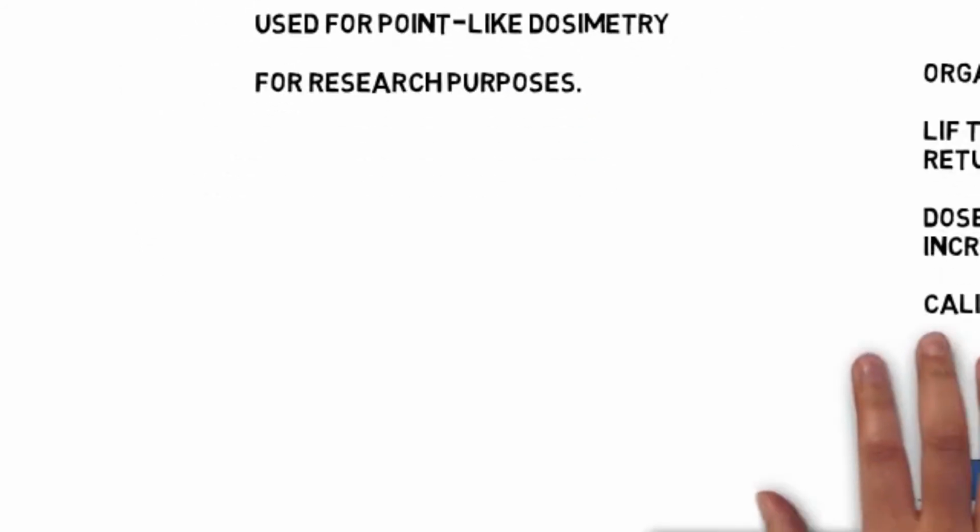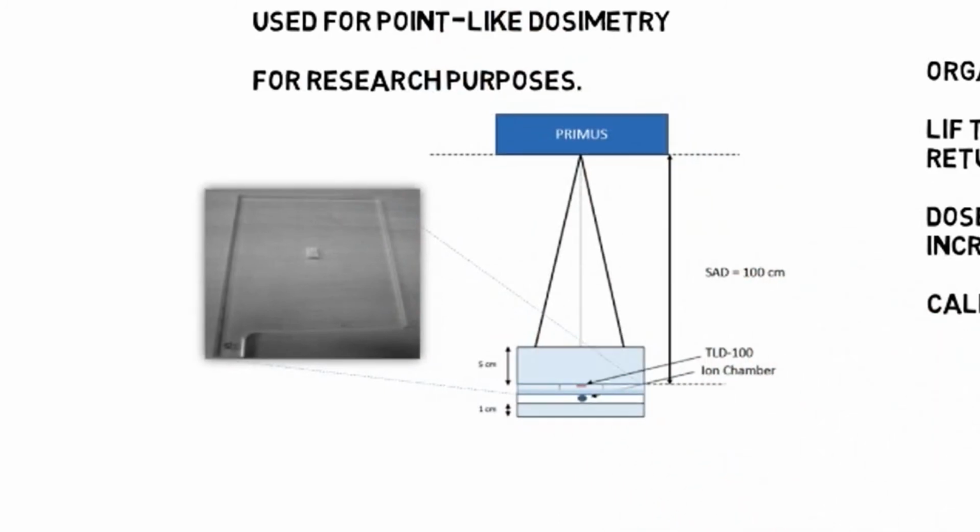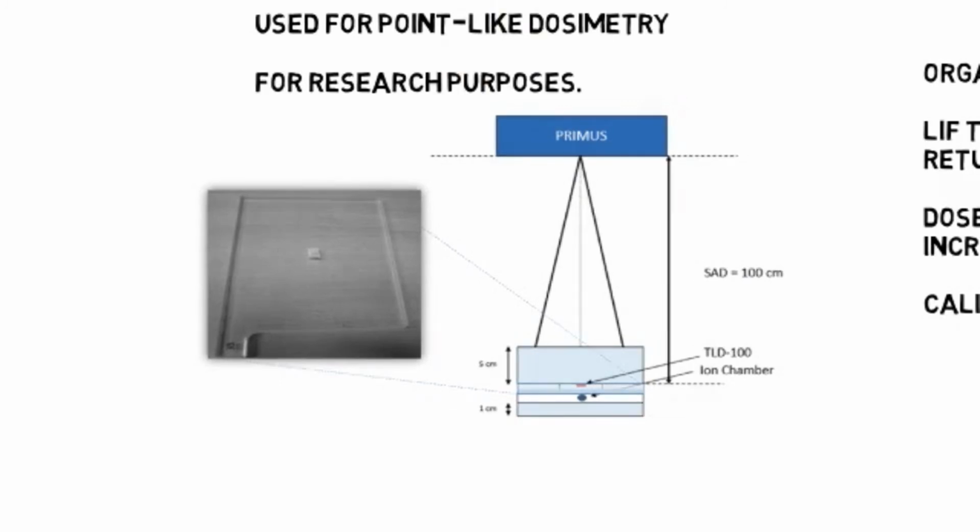For photon beams, the mini phantom is placed on a platform which is located at 100 cm from the source, with the mini phantom located on top of the platform in the center of a 10 cm x 10 cm field. For electron beams, the top of the phantom is set at 100 cm from the source. Any difference between this irradiation geometry and the Linac calibration geometry is accounted for with appropriate geometric and TMR corrections.